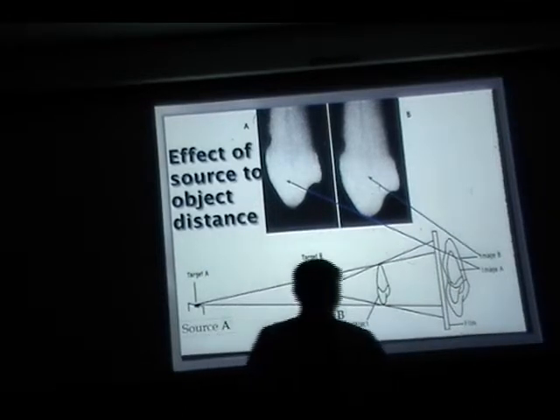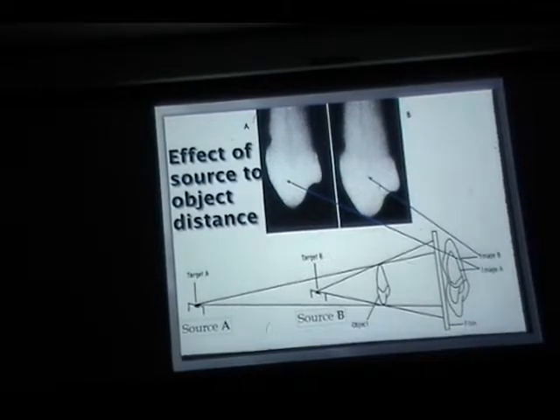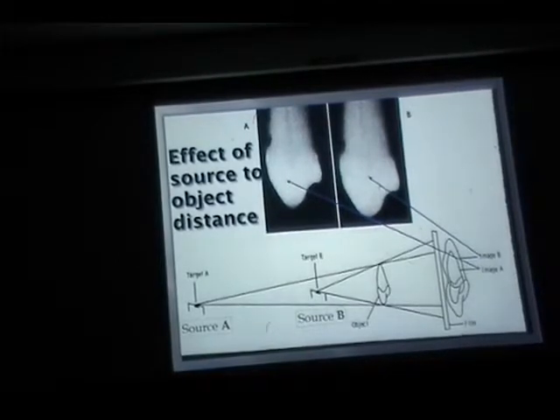Yes? So you get not a realistic image, I'm trying to say. If the distance isn't right, the working length may be skewed, right? So if the tooth size is 10 millimeters, and you're taking this kind of image, then you get 12 millimeters, then you put a 12 millimeter file there, it's beyond the apex. Okay?